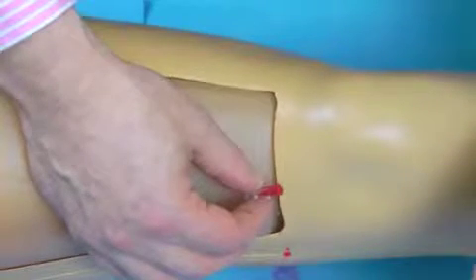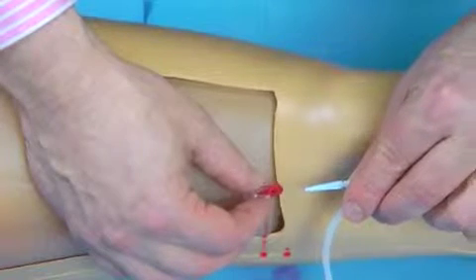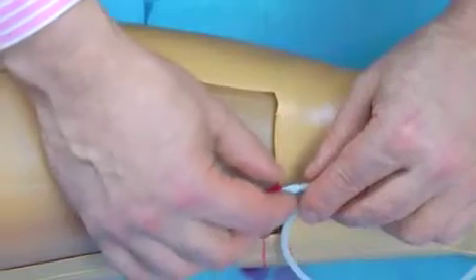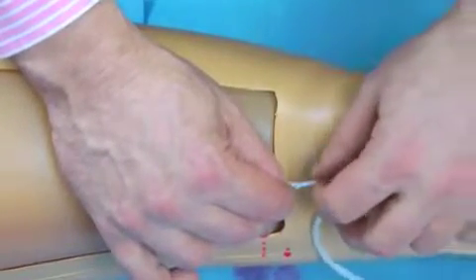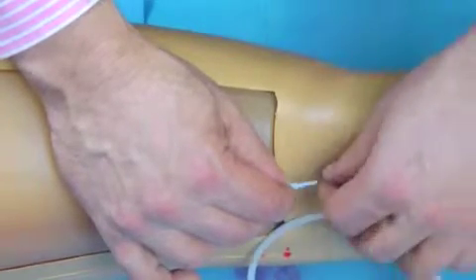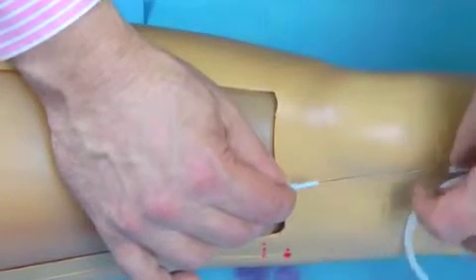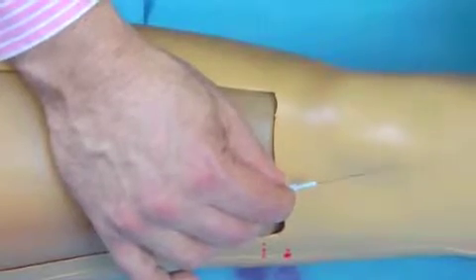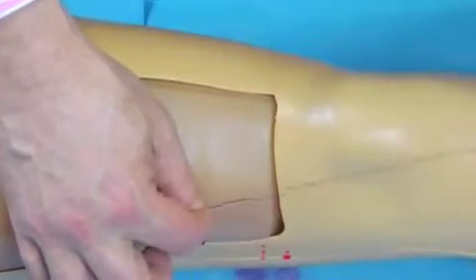When we've got flush back here into the end of the micropuncture needle, we can then get our guide wire here with the little introducer, and we can put this straight down the end of the micropuncture needle. Once we're in place there, we can push the wire up inside the vein. Once this guide wire is inside the vein, we can use the ultrasound to make sure we're in exactly the right place. Once that's in position and we can see where we are, we can then remove the needle, leaving the guide wire in place, ready for the Seldinger technique.